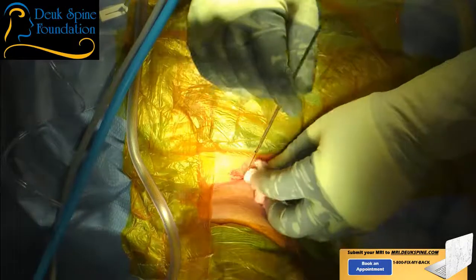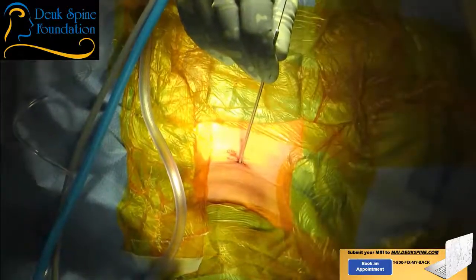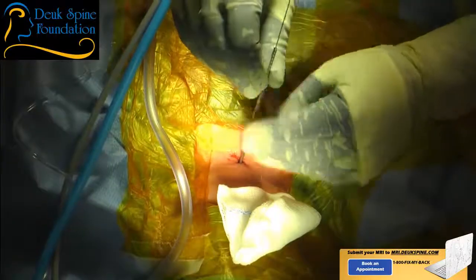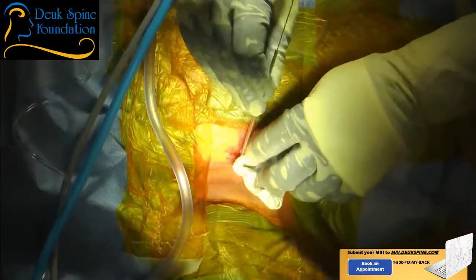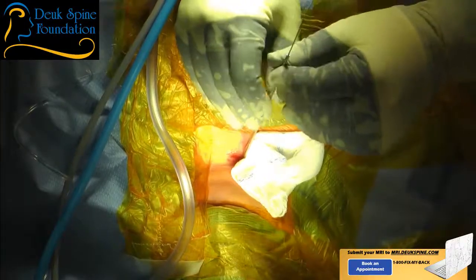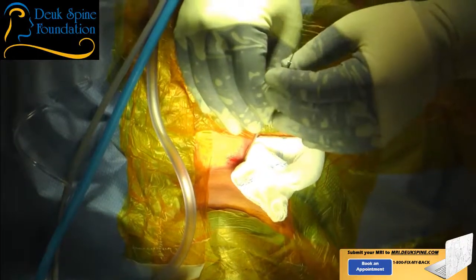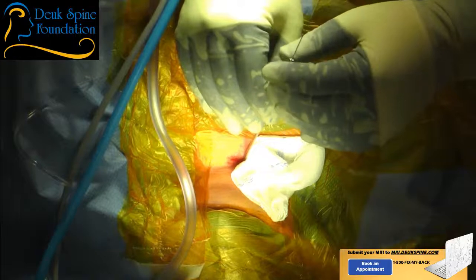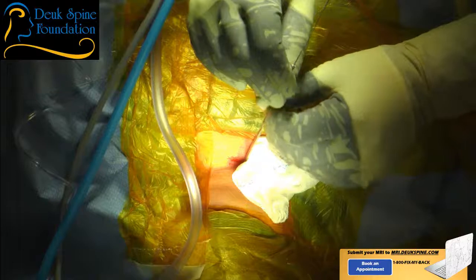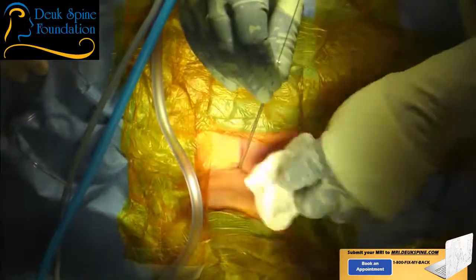Now, I will need a lateral and I'll need a shoulder pull. Nice and slow, easy, gentle shot. All right, so I'm checking my guide wire. I don't want it going forward into the spinal cord. That would be bad. Shot. So you want to make sure it stays planted and not move. If it goes into the spinal cord, the patient could probably end up paralyzed, which you don't want. That's how the Koreans got in trouble doing anterior cervical endoscopic surgery and why they stopped doing it.